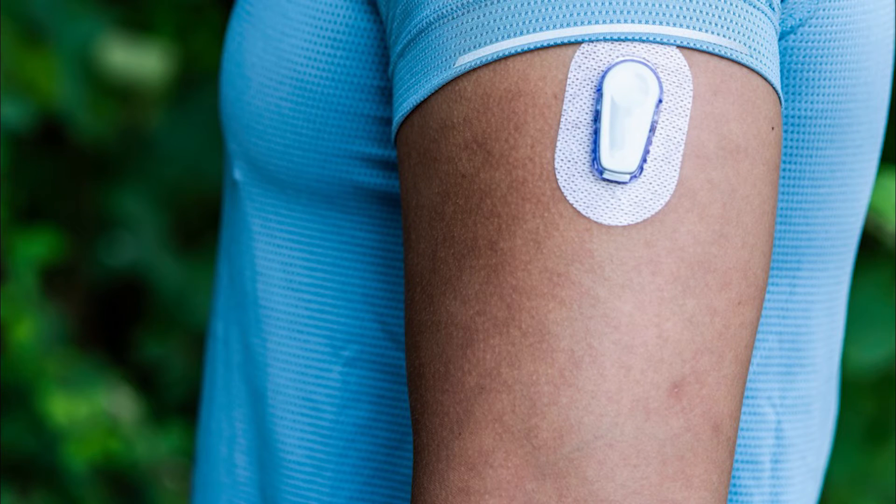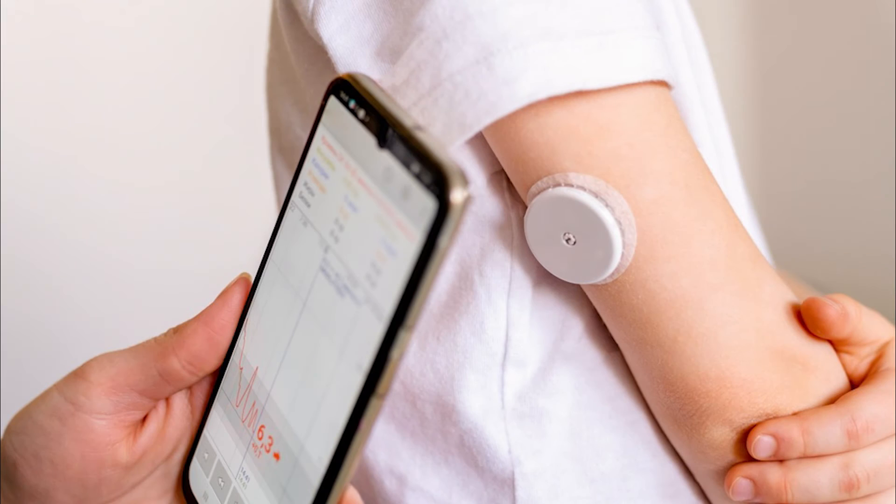Another way to check your blood sugar levels is with a continuous glucose monitor. This device automatically tracks your blood sugar levels throughout the day and night. The sensor sits on your skin, usually on your belly or arm. You can see your sugar levels at any time on your smartphone or electronic devices. Talk to your care team to see if a continuous glucose monitor is right for you.